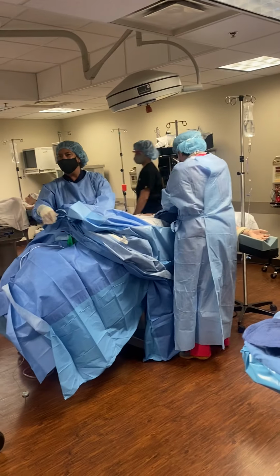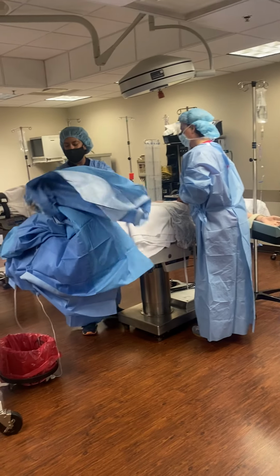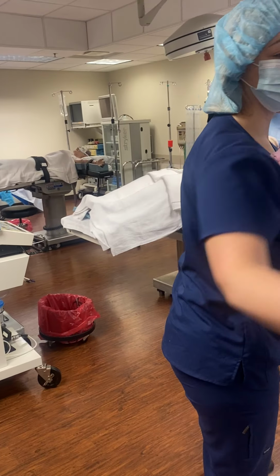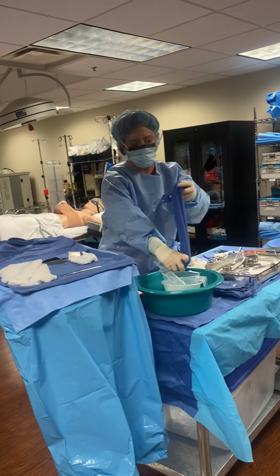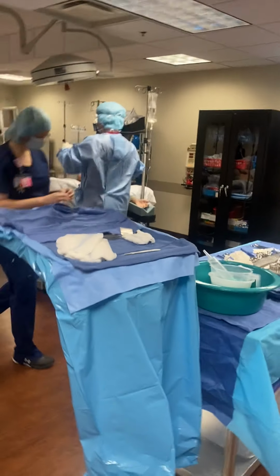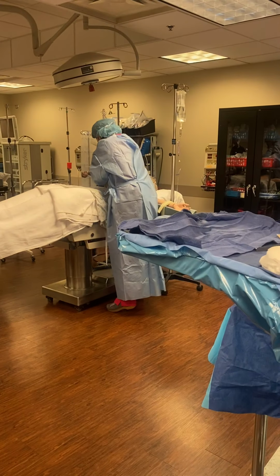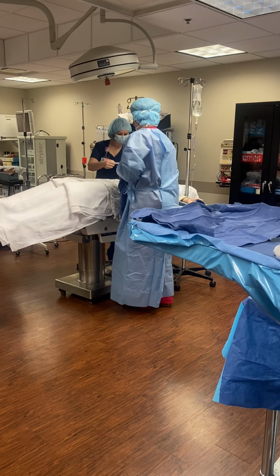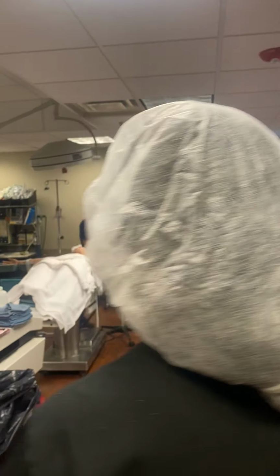And all the cords and everything normally just get rolled up. Okay. It's a scrub, it's a habit. Circulator would take the dressing. And then a lot of times what I'll do is I'll just use a towel, or if I have laps left over, I'll just get a wet one. A towel works good, wet the tail. That way you can wipe off, wash the patient. Protect the dressings, don't get them all schmutzy. Keep it dry. Okay, that's it. That's how we do it. This is how we do it, baby.